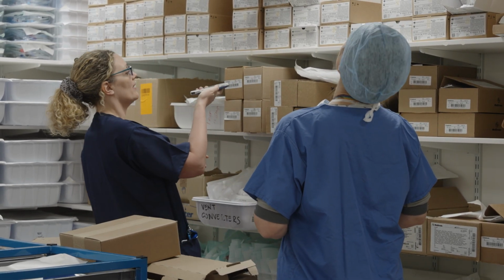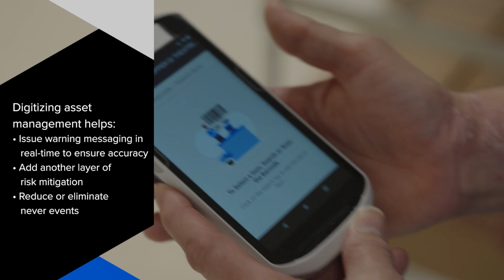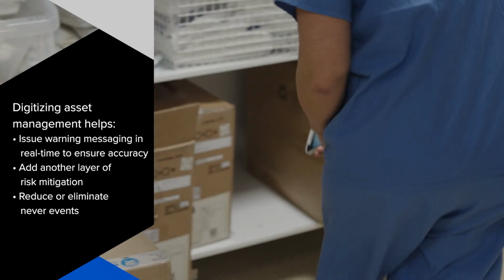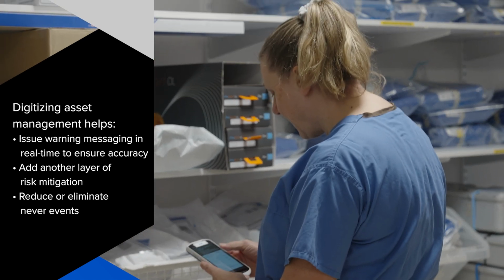But by scanning the product, you can then set rules within the system, which we do, which then says, wait a minute, in real time it flags a warning message that says this product is a right knee and is incompatible with the procedure that you're carrying out, which is a left knee. And it provides an extra red flag so that we can stop the line, we can double check things without having a never event or a serious consequence of patient harm, which is what we seek to avoid at all costs. So for us, this just gives another layer of risk mitigation.